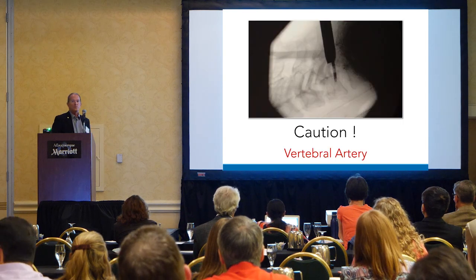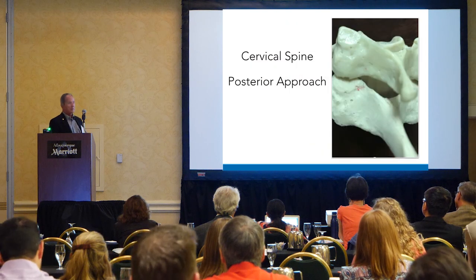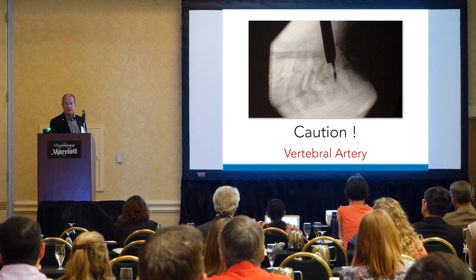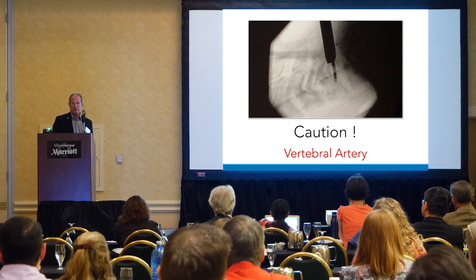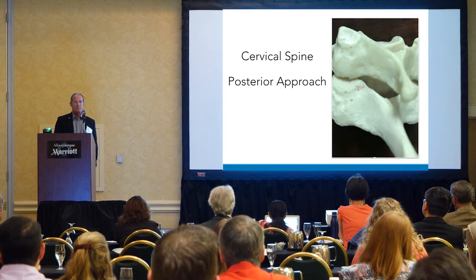Caution, you always wonder what can go wrong. Right in front of that little thermal probe is the vertebral artery. That's the only thing that can really get you in trouble in this approach. So look at how far anterior you are on that, but if you keep going, you're going to be right in the vertebral artery. Well, that's a posterior approach, cervical spine, thank you.